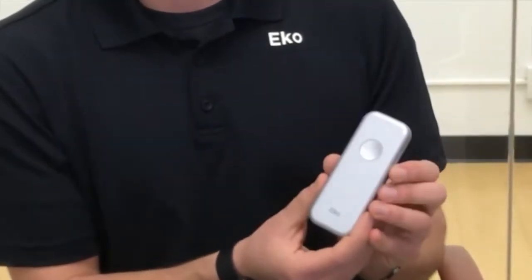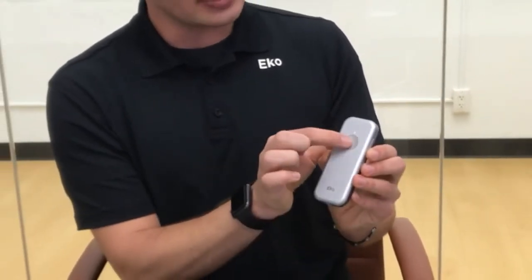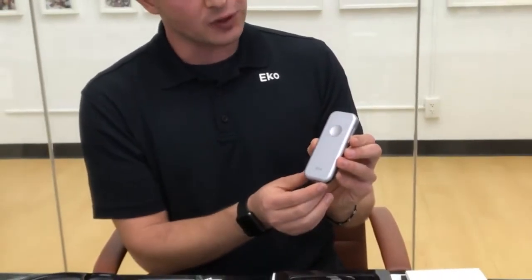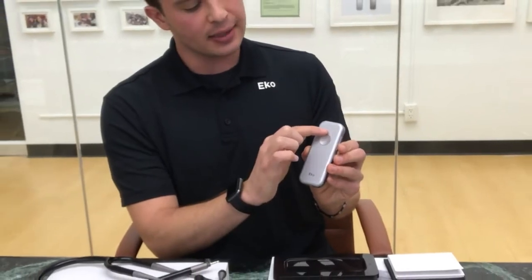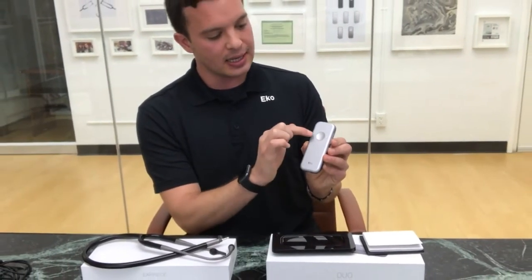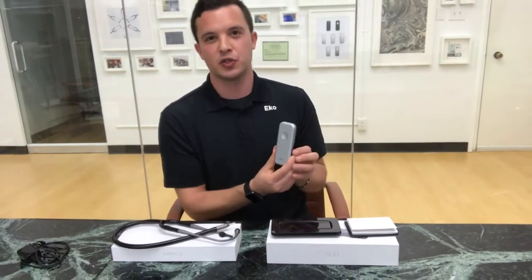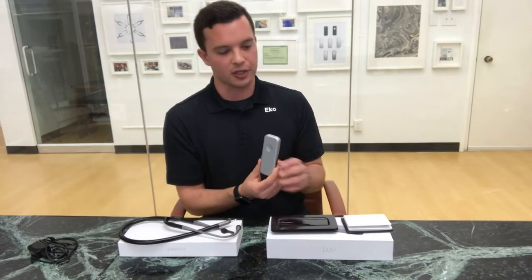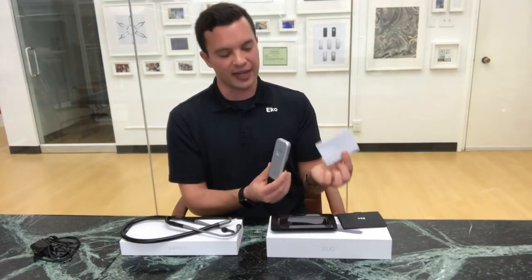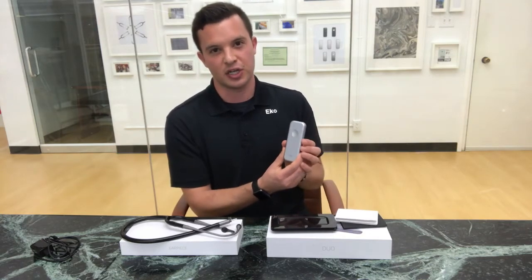The DUO comes with four preset stethoscope audio filters. To switch between these filters, simply tap the center button three times quickly and you'll notice the LED light change from the 12 o'clock, three, six, and nine o'clock positions. Each of these positions corresponds with an associated filter. In the DUO quick start guide you'll find a graphic that will remind you of the associated filter for each one of these positions.